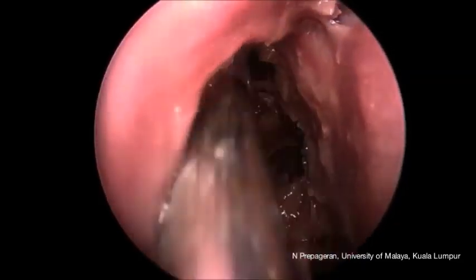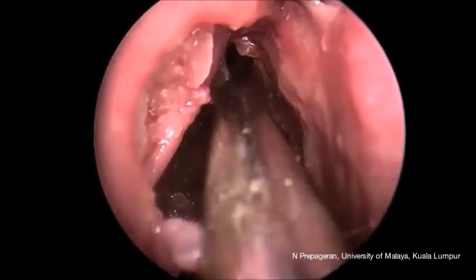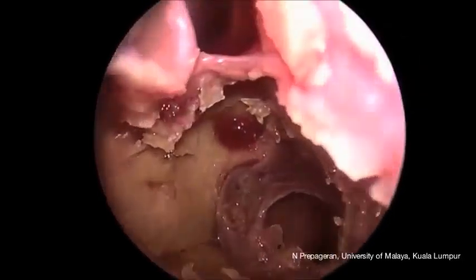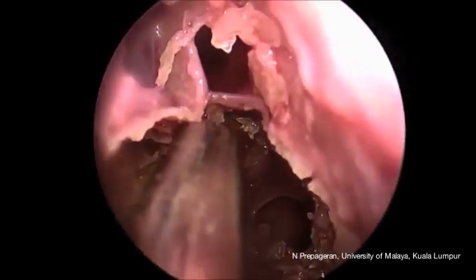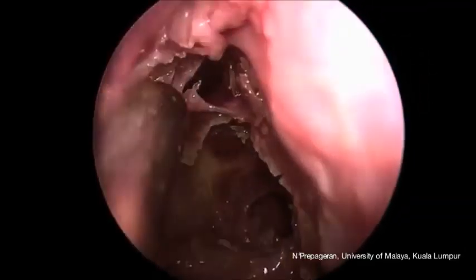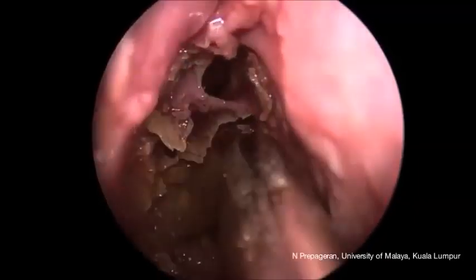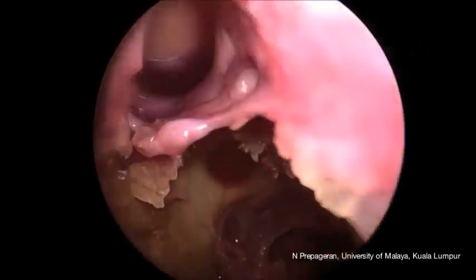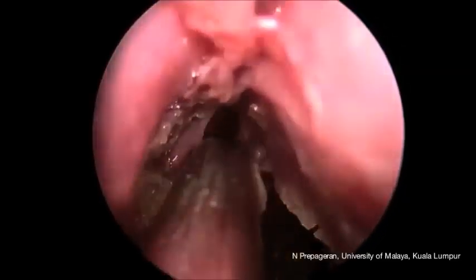And up here, we're having a view of the frontal sinus and possibly the anterior ethmoidal artery. Let's confirm that a bit afterwards. But you can have a very nice view of the frontal sinus ostia, as you can see up there. Just let's clean up a little bit more. And how do we know that we're in the frontal sinus?